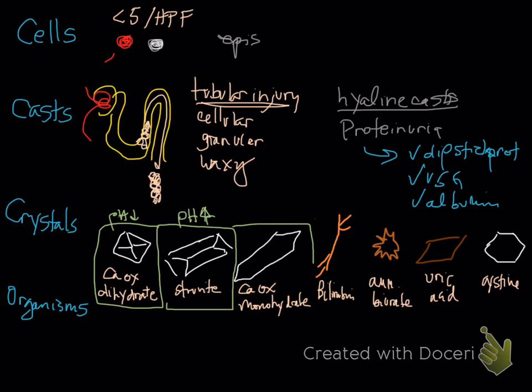Of course, calcium oxalate monohydrates, that's one of our deal breakers, so I'm going to put some stars around it. And of course, this we see with ethylene glycol, as well as other oxalate producing things, and some of those are dietary. I mentioned this in class, so there's ethylene glycol. How I remember that calcium oxalate dihydrates don't kill you is because it's ironic and it starts with di, whereas calcium oxalate monohydrate actually looks like either a picket fence, so if your idea of death is suburbia, remember picket fence, or if you hate vampires, remember it looks like a stake.